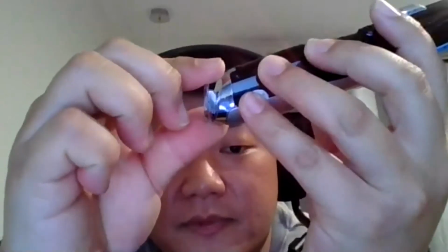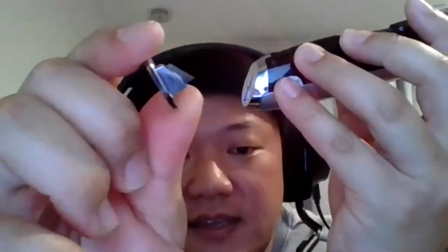Then you want to use your little cleave tool, which is found at the bottom of the unit behind the battery cover. I'll just find that for you. So it comes off at the back here, you lift that up. You're not actually going to use this little sharp tool to just hack away at the fiber optic. You want to put it on a nice flat surface and make a nice straight line.